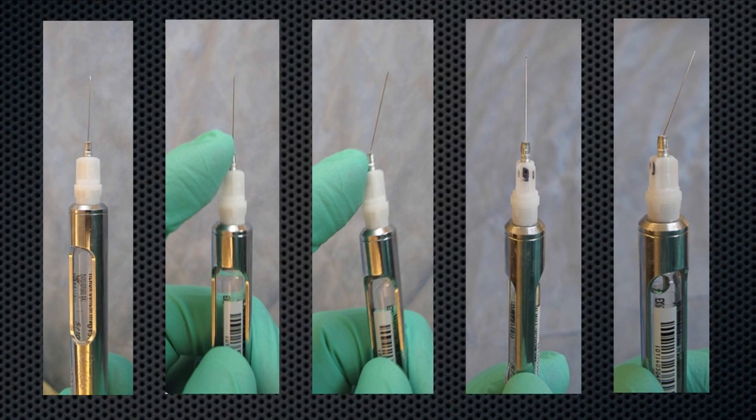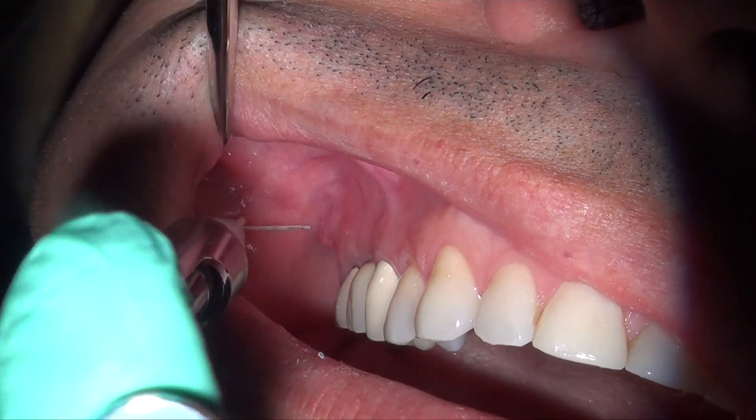Now it's time to introduce my friend Ralph here. Ralph has agreed to join me to demonstrate this technique for you. The best way to practice anesthesia is to obtain a dry skull so that you can go over the bony landmarks that you need to know before you can administer this shot successfully. The idea is to have adequate pre-anesthesia before injection with a thicker gauge needle in order to reduce injection pain, needle deflection, and also the false negative aspirations that can happen with thinner needles. It's also helpful to bend the needle a little bit so you can get better access to the bone.